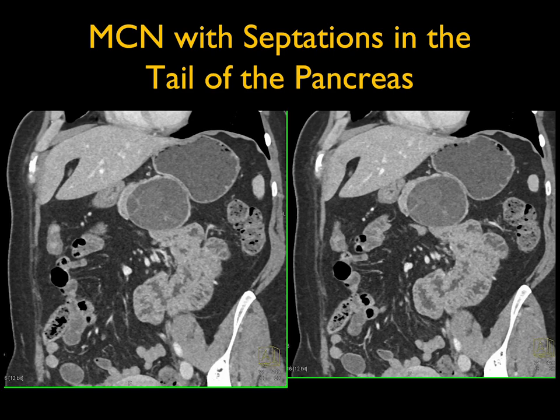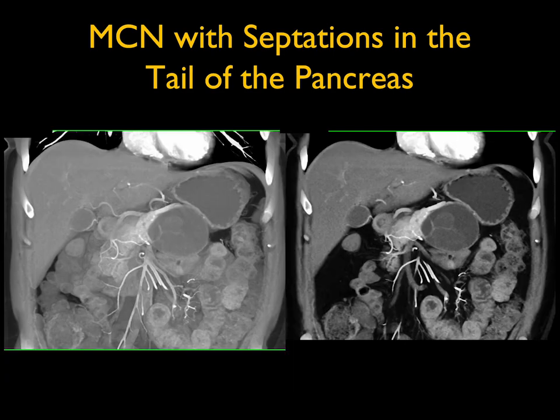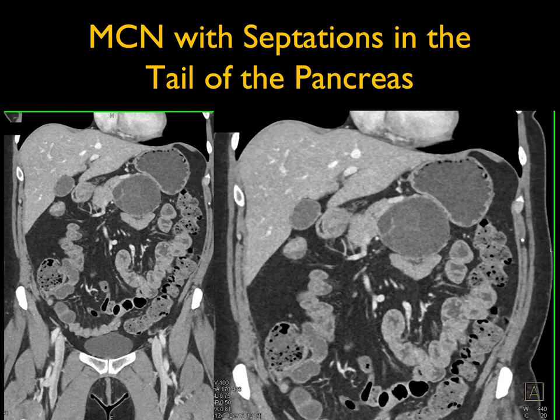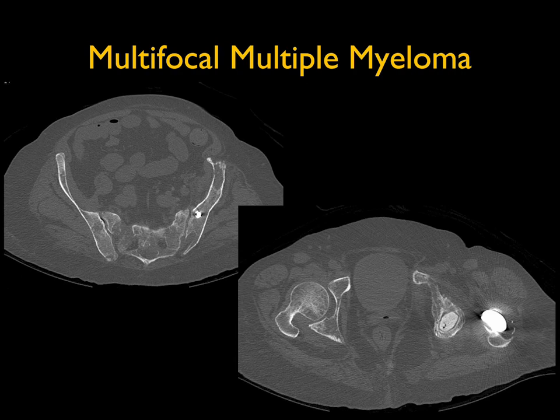A beautiful example of a cystic MCN with thickened septations, great location, no dilated duct, and sometimes distal glandular atrophy. The 3D imaging often shows the septations better. When septations get thicker and the lesion exceeds four centimeters, the likelihood of malignancy increases. This MCN with thick septations and increased density was indeed early malignant.